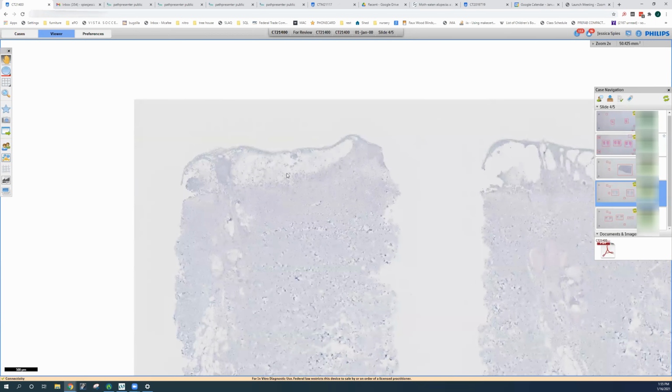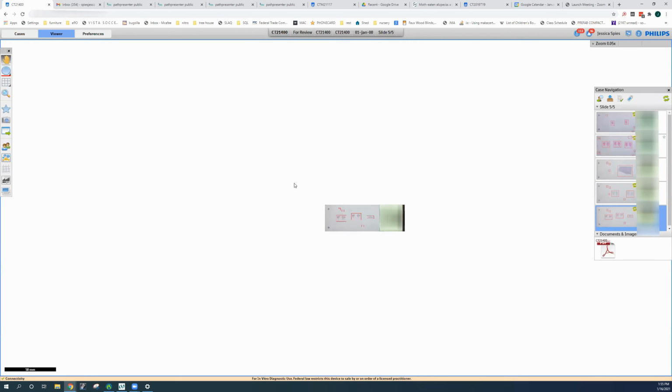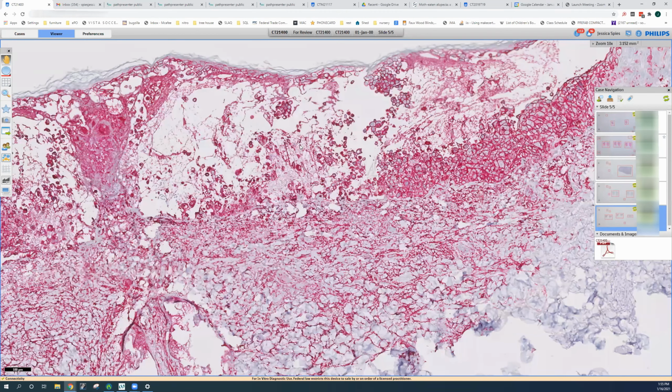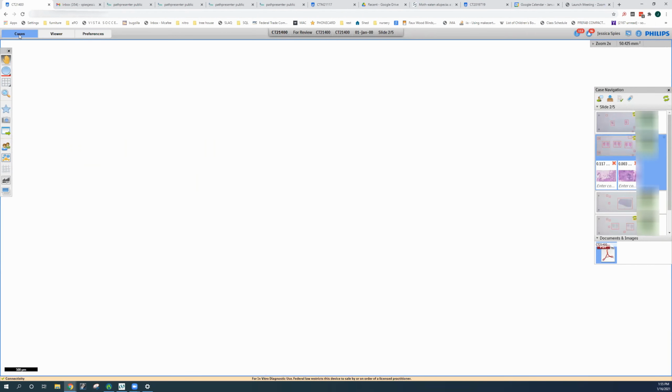Here is the herpes simplex stain, and you can see it's actually a red immunostain. It is completely negative. Here is the herpes zoster stain. Beautiful positivity. Actually, we'll keep this for a control tissue for our lab. Amazing. Look how many cells are staining. All right, next case.